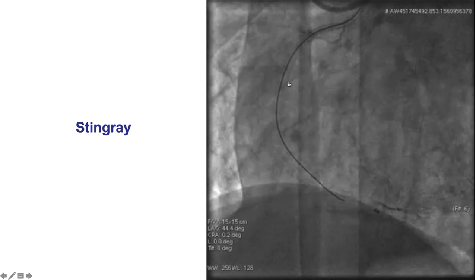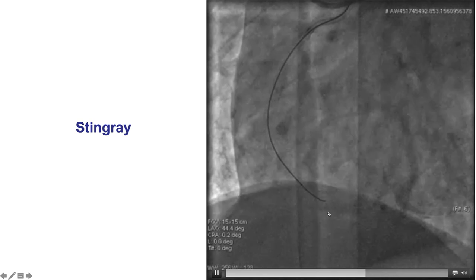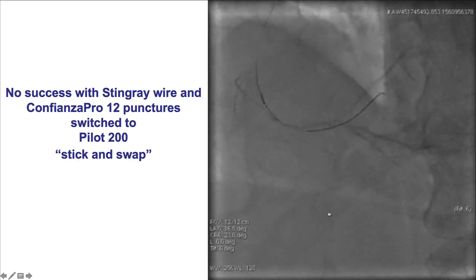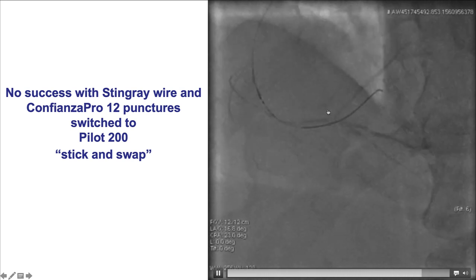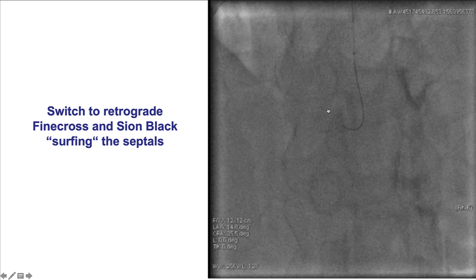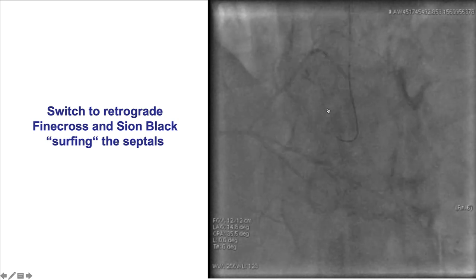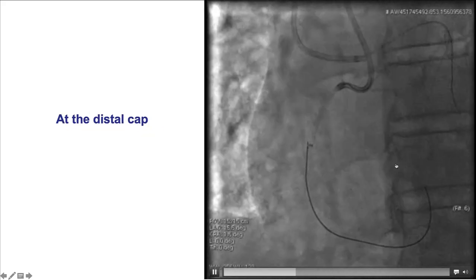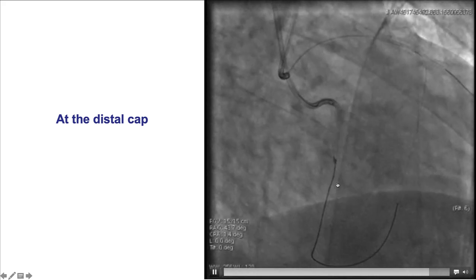Subsequently a Stingray balloon was advanced, but again there was extensive distal hematoma and reentry was challenging. Despite multiple attempts using the stick-and-swap technique, reentry was unsuccessful. Because of that, a decision was made to switch to retrograde crossing, which successfully crossed the septal collaterals. Now we have an antegrade guide extension and a retrograde guidewire.